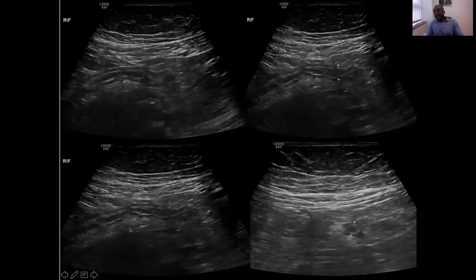So we asked the patient, where is the pain? Here. We placed the probe there, and we saw this. This was done after we had scanned everything else: the liver, kidneys, gallbladder, ovaries, and everything else. So this is the appendix there, and it measured 7 millimeters. It was non-compressible, blind ending tubular. On transverse, you get a target appearance, and you can see it there.